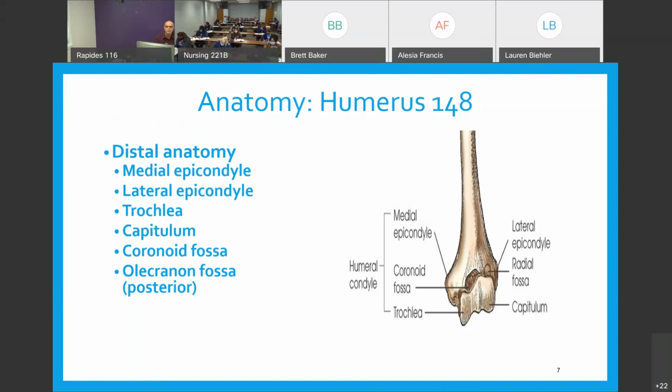What your focus needs to be on is going to be the shoulder, the proximal humerus, because that's new material. The lower distal portion of the humerus is going to be a review for you, but we're still going to use it as a positioning guide for the humerus and the shoulder. So we're going to go right back down to the elbow, and we're going to start palpating those two little knots that we've been palpating for a month now in school, right?